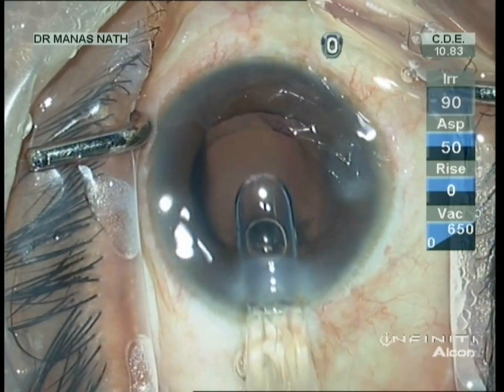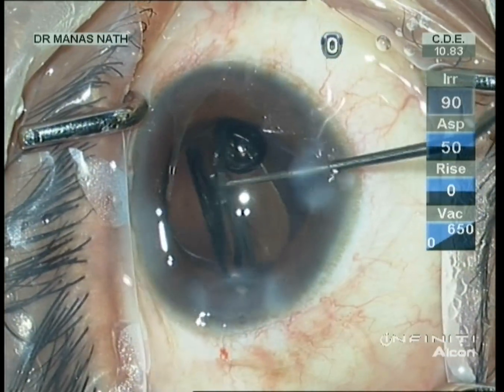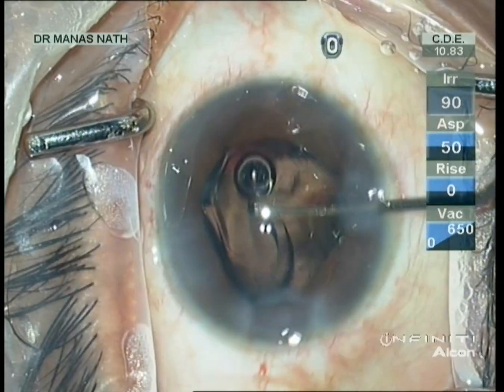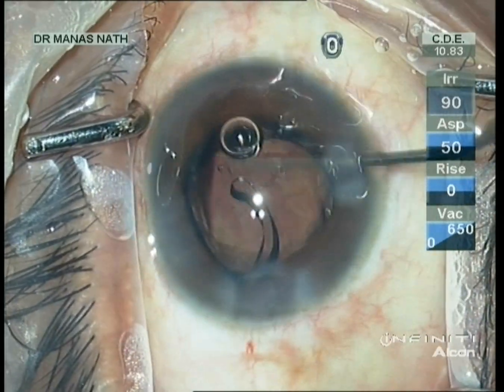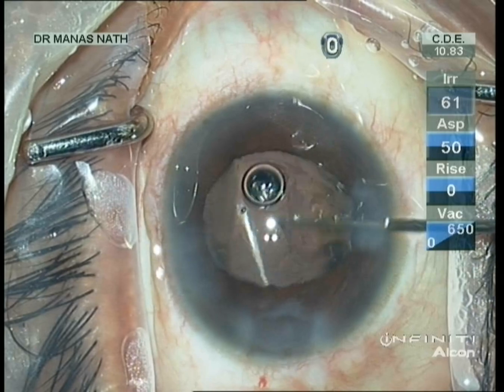Now I am implanting a single-piece lens within the capsular bag. You have seen that the dense cataract with posterior polar cataract has been successfully conquered. The lens is placed in the capsular bag.